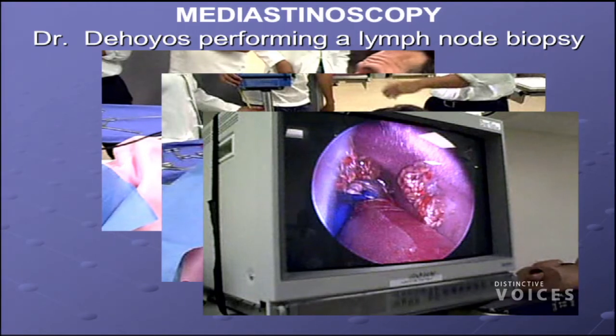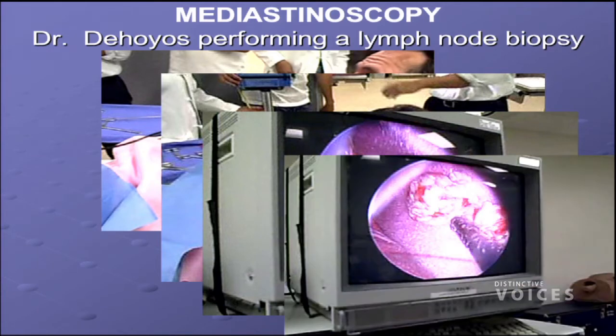It's filled with blood. So if he accidentally hits it, then he'll get some bleeding and have to deal with that. That's another view once he got a ring around the lymph node, and then he was able to pull it out.